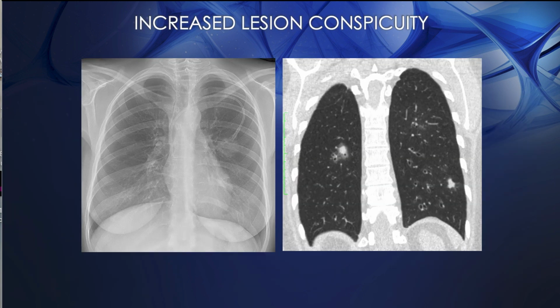All right, I'd like to show you some chest cases now. This case to me is very important to show. These images were not acquired with the ARC. These were acquired with a digital tomosynthesis instrument, but they illustrate an important point. We all know that lung nodules with ill-defined borders are very challenging to see on chest radiography. It is because of the gradual fall off in attenuation, without that sharp edge, it is difficult to see them.